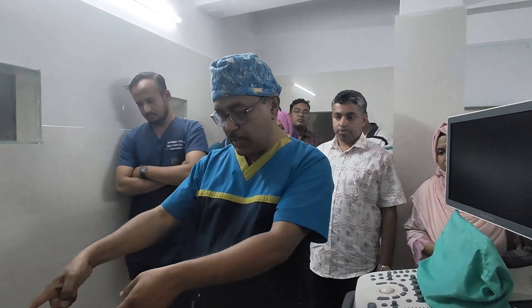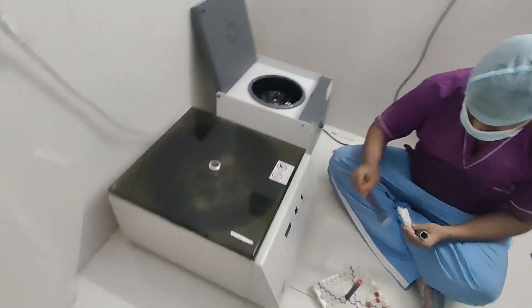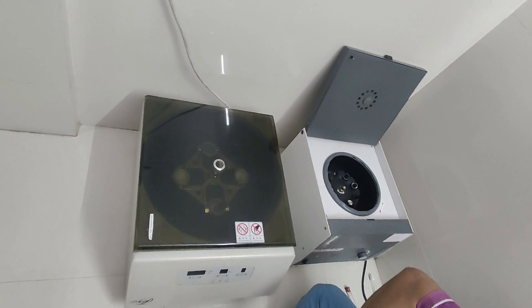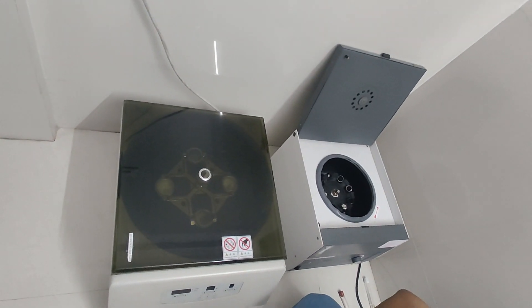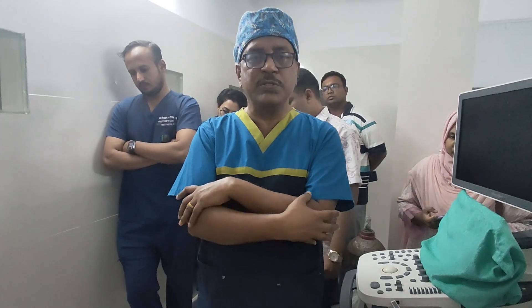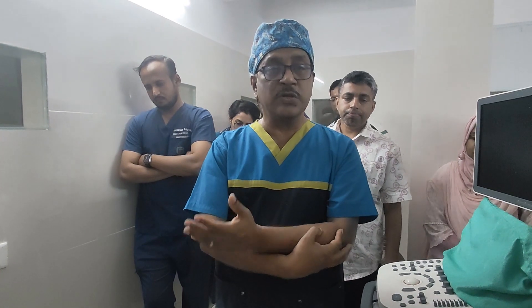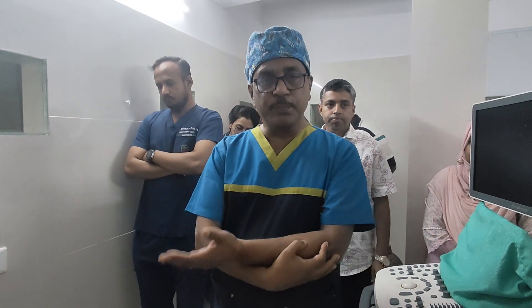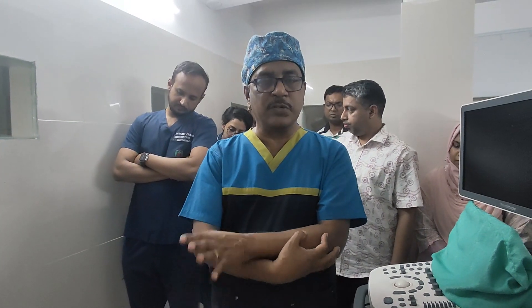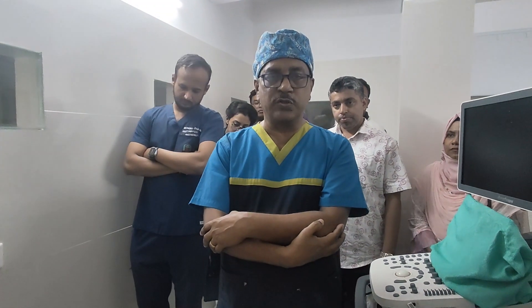Here we have two machines. The one on the left is a temperature-regulated machine — it is a costly machine, around 3 lakh rupees in Indian price. On the right is the non-temperature-regulated machine. Recent studies confirm that temperature control is not needed to prepare PRP, so we most commonly use the non-temperature-controlled machine, which is not costly.